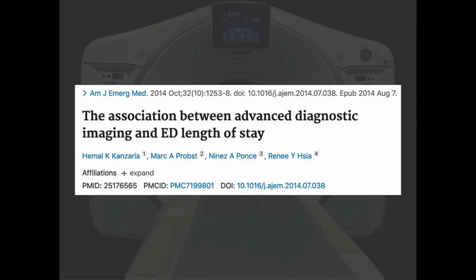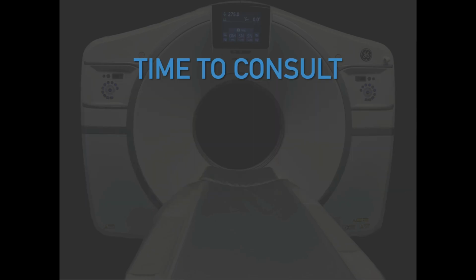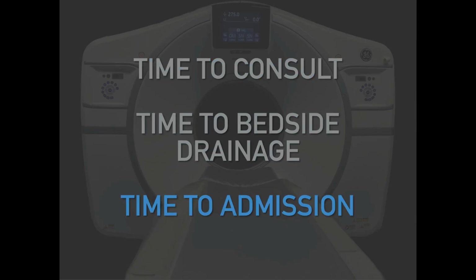On top of that, there have been a lot of studies showing that anytime you get advanced diagnostic imaging, there's going to be a delay in disposition. In particular, in folks who had CTs for peritonsillar abscesses, there's been a study that looked at this and showed essentially you're going to have a delay in time to consult, a delay in time to bedside drainage, and a delay in time to admission. So CTs mean the patient stays here longer. I think we can all agree that that's something we don't like, right? We want our patients to be cared for, and we want them to be cared for quickly. And CTs sometimes slow that down. And that's not unique to our system. That's seen in a lot of other places.